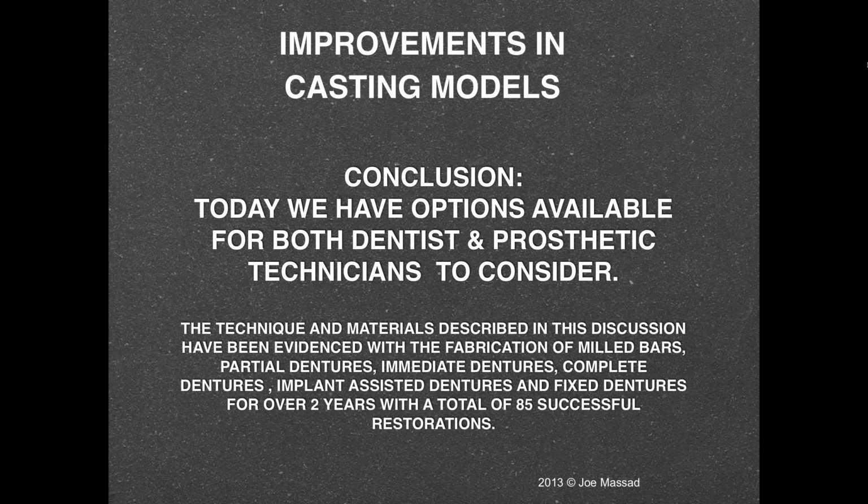The amount of redos, and this can be verified with our records, but we have not published this yet, was about 2%, which is great. And that 2%, we actually found out what the problem was, and it was if you don't get your impression coping back in exactly, or you don't close up the head of the locking screw many times, that will do what? Well, a little material gets in there, and you don't seat the impression coping all the way back in. So it was an error that we actually had.